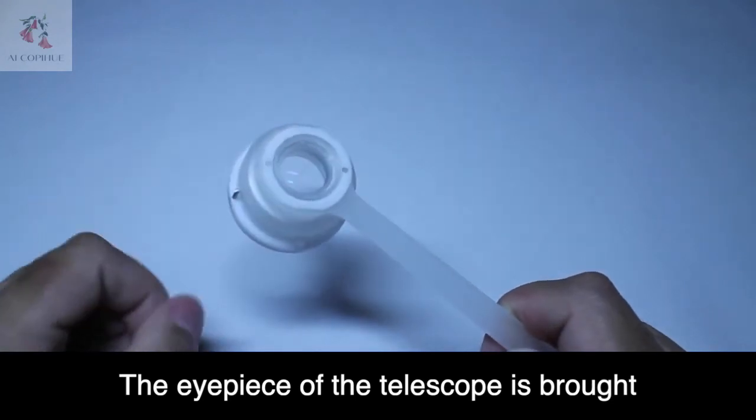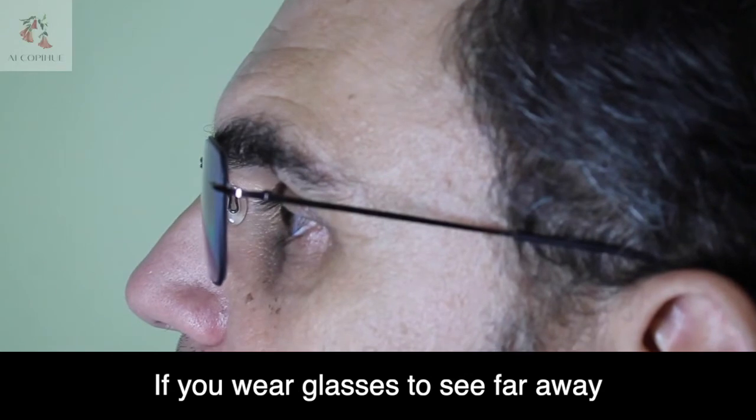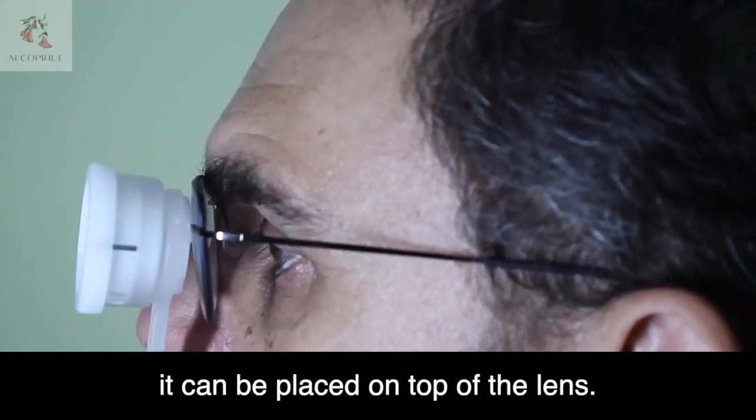The eyepiece of the telescope is brought as close to the eye as possible. If you wear glasses to see far away, it can be placed on top of the lens.